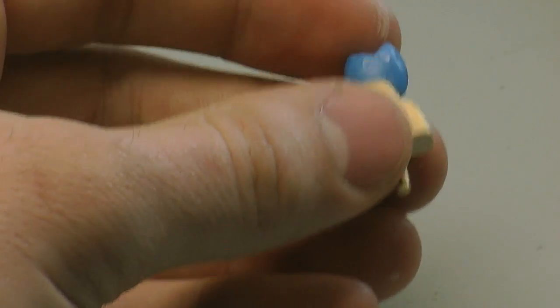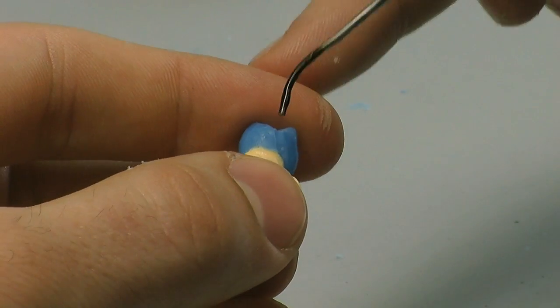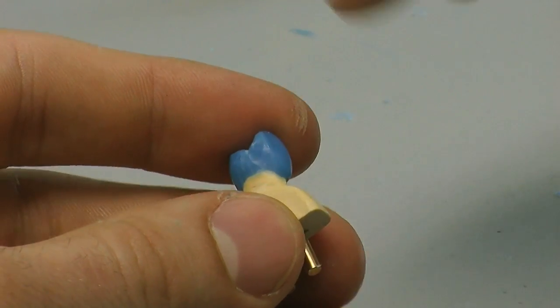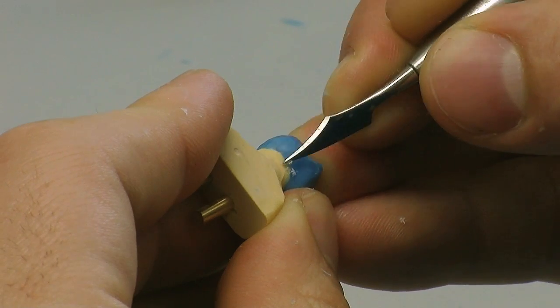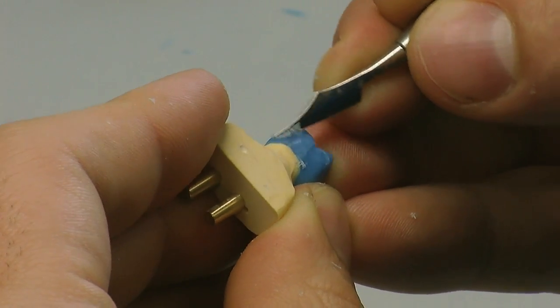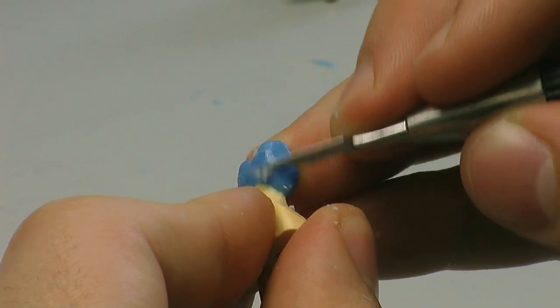Each unit is treated this way, really precision around the margins, really important that you get the profile correct. You can wax up on solid models, which is a very good way because you can sort out your soft tissue. If you have areas of soft tissue that you need to really wax into, you can always cut them back. You can seal them and then you can wax onto them. Or of course you can use a soft tissue model. Sometimes it gets a little bouncy, but if you contour it first or use the rigid, then that's fine.